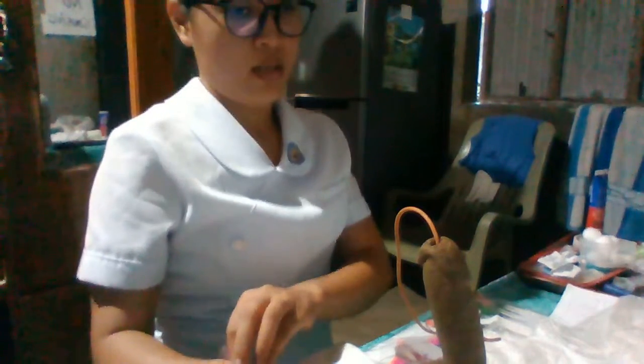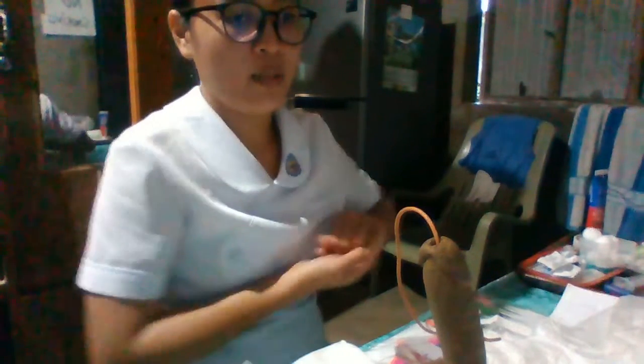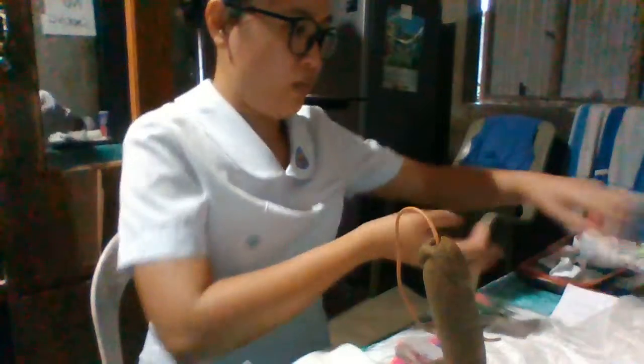Then next, we have to put on gloves. Then apply a sterile drape over the patient's perineum.